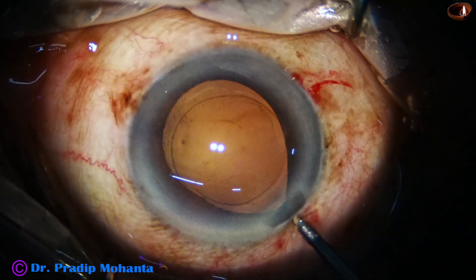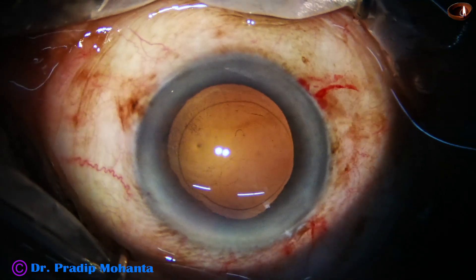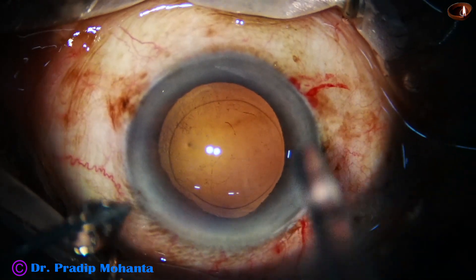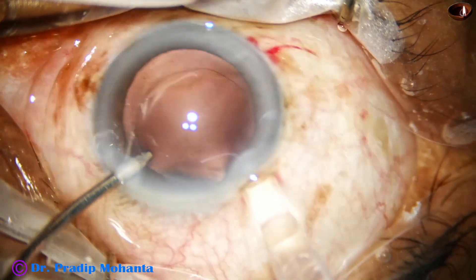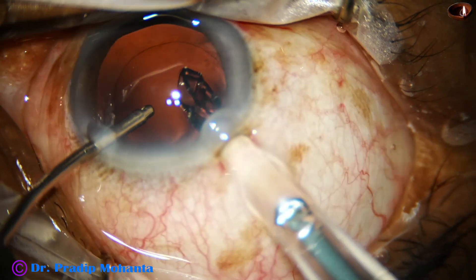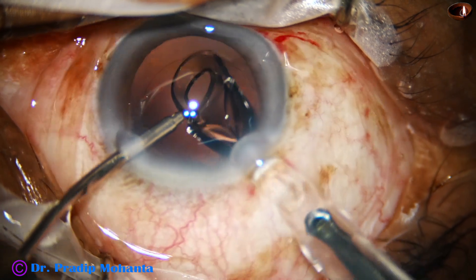But I find that the iris is prolapsing through the main wound, so enough clarity is there. Now hydro-implantation of a single piece monofocal aspheric intraocular lens is done.